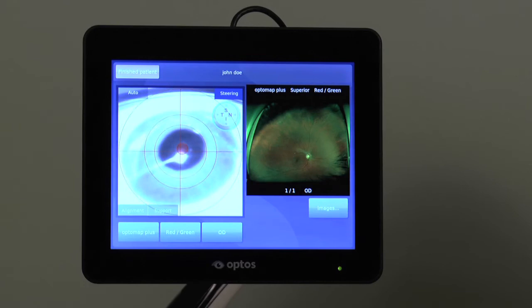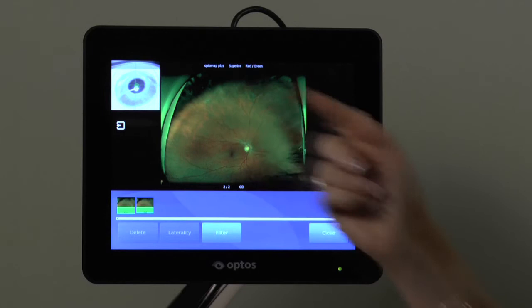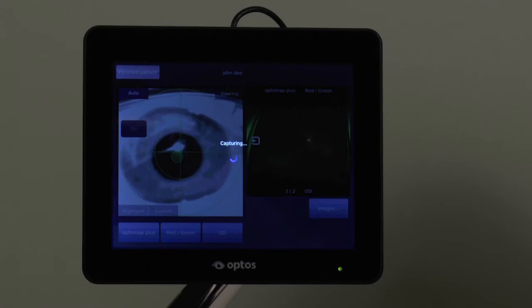Notice how, in these examples of superiorly steered images, the central pole is now lower and we are able to see considerably more of the superior retina. Auto-capture may be enabled by selecting the auto button and choosing on, which will result in the device automatically capturing an image when the patient is aligned and the target turns green.